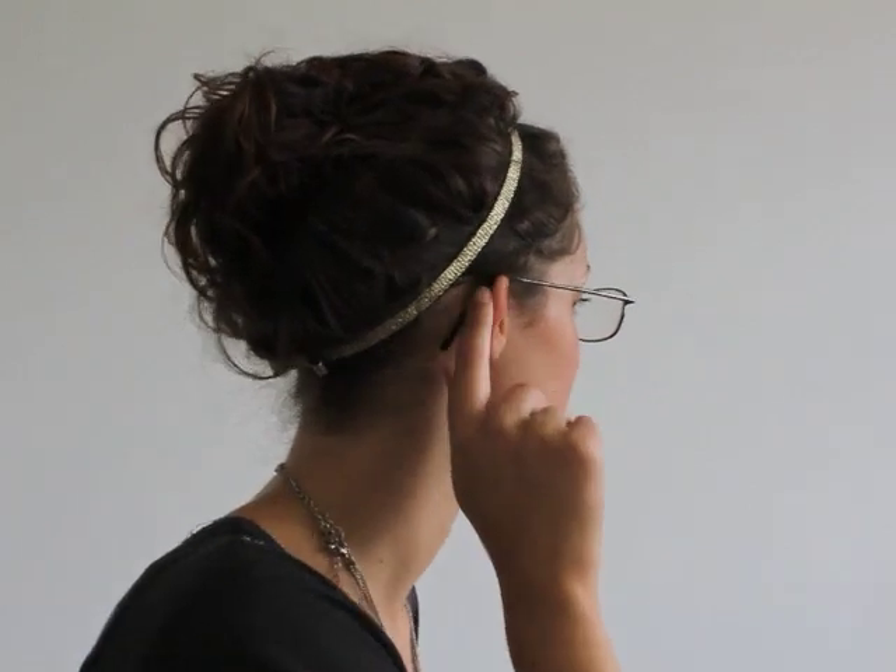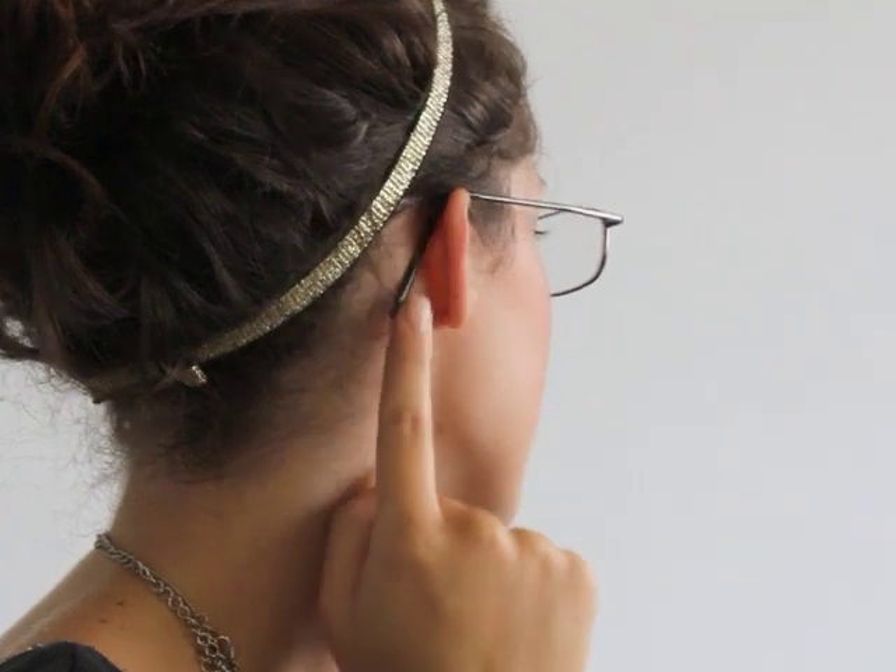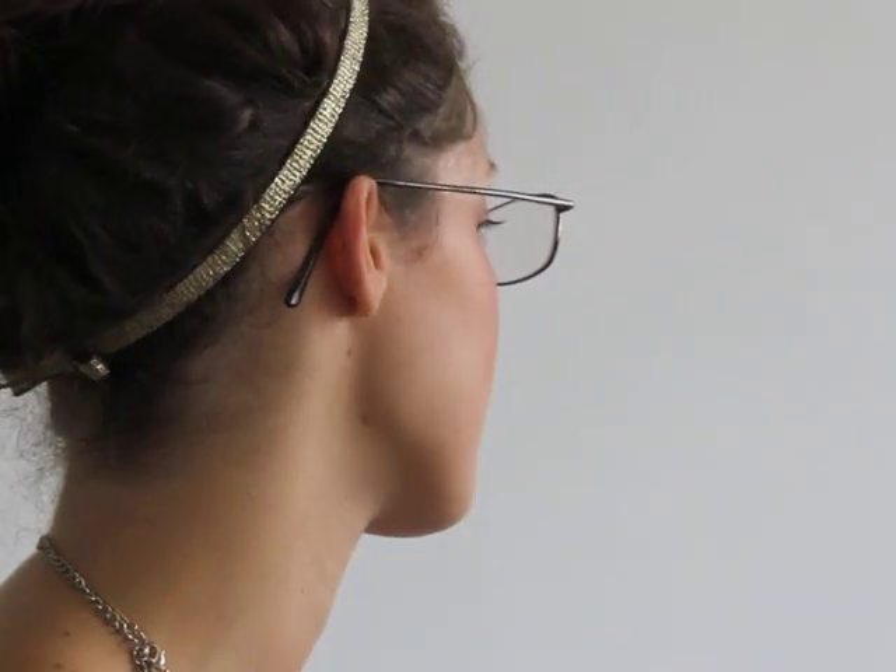You can also see that the sides were very long and not gripping behind the ear. Now behind the ear, the side is following the curve of the ear much better, so there's much less likelihood of them falling down her nose.